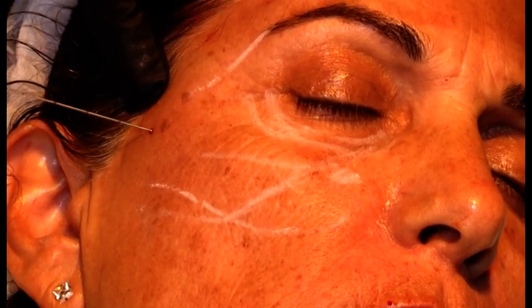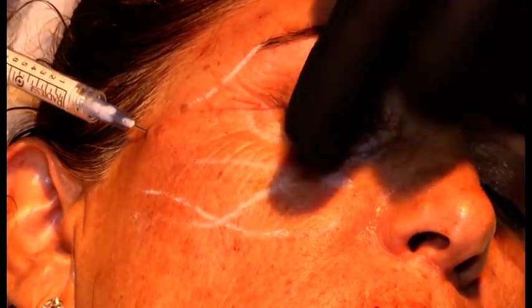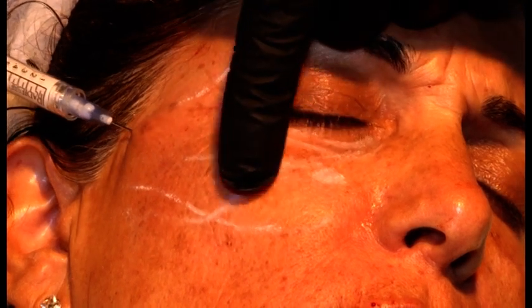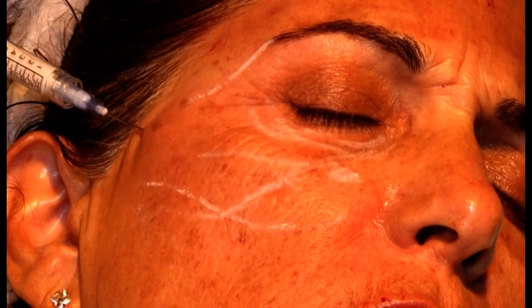And so what I will start is, first of all, I will go down just inferior to the infraorbital rim. Lateral orbital rim, this is the place that needs a little bit more light reflection. So a little bolus and a retrograde.